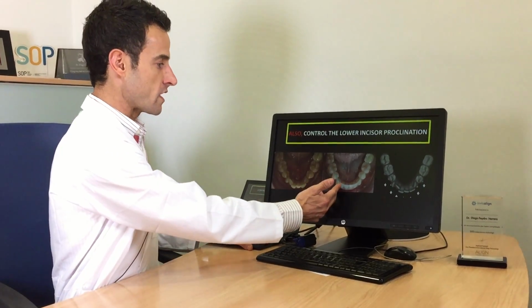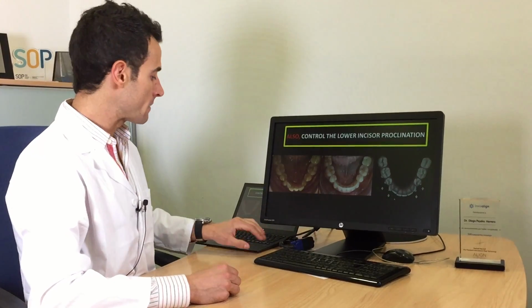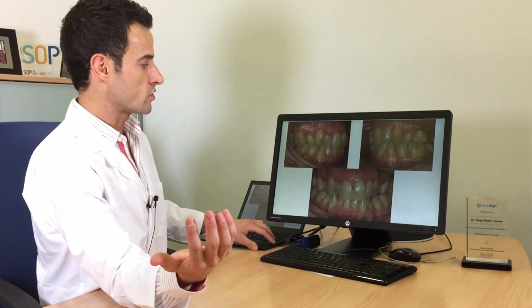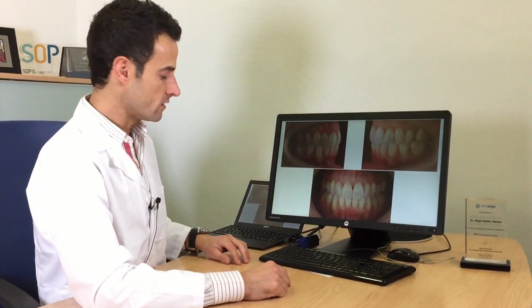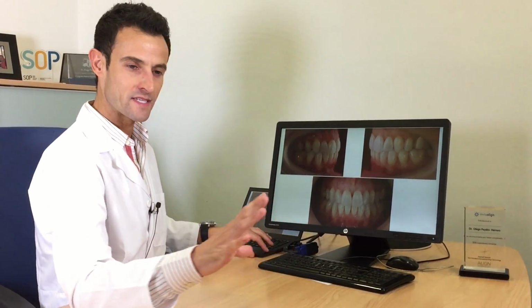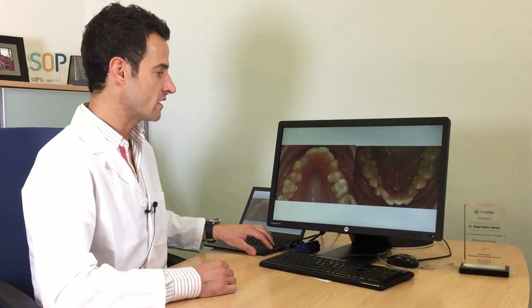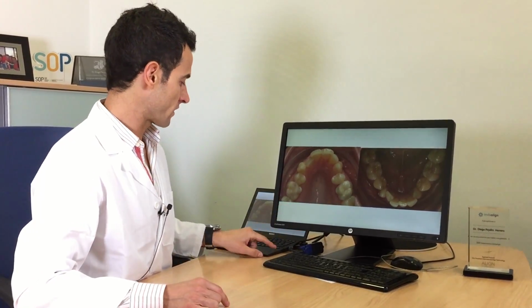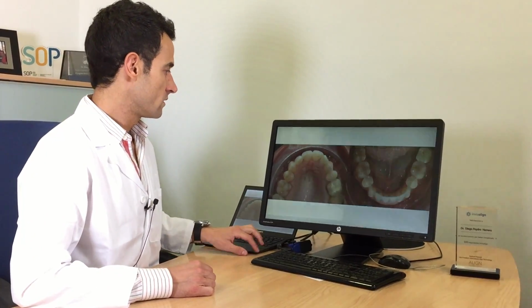Okay, amazing change from here to here, doing everything together, with some IPR. And well, this is the evolution from here, this disaster, to here after a bleaching that my sister did. You know, my sister is an amazing doctor working in aesthetics, and she does this beautiful result with the bleaching. How we move from this problem, look at the rotation here, and how we move it to this final position.